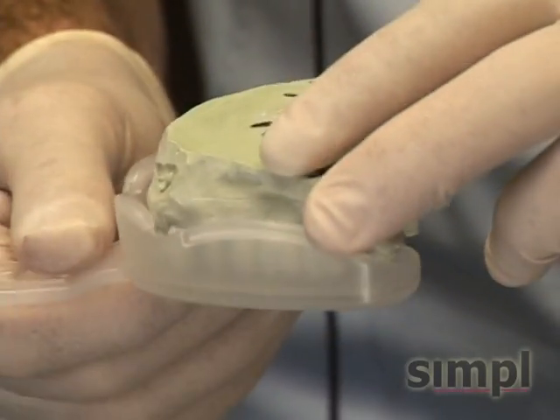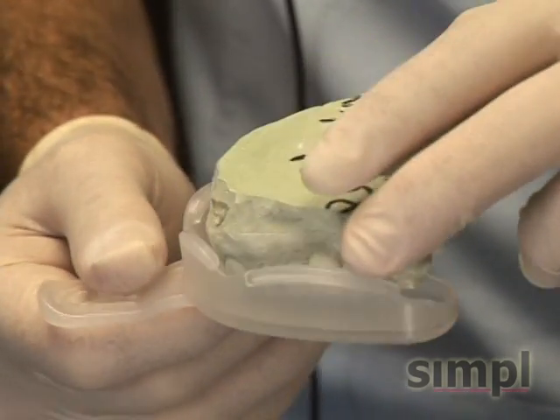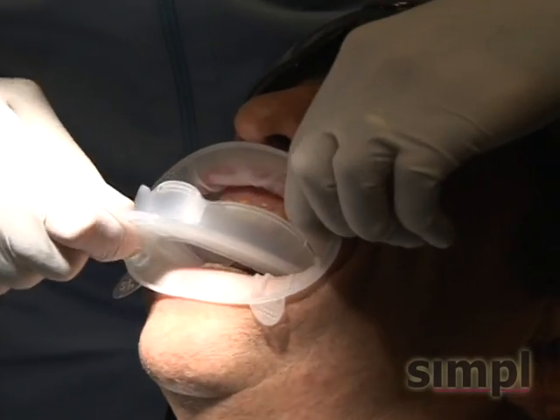Checking the fit of the tray. This is a stock tray. Can be also done with a custom tray. And we'll check it in the mouth. And it's fitting real well.